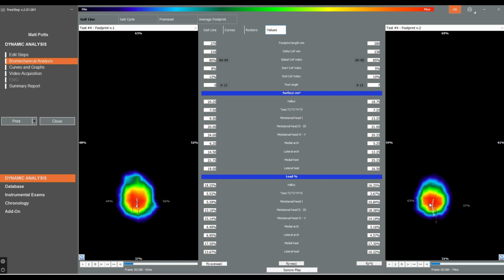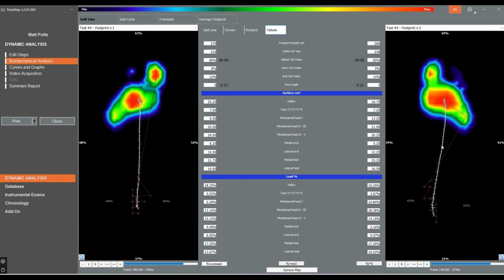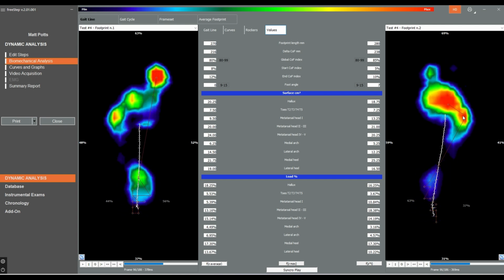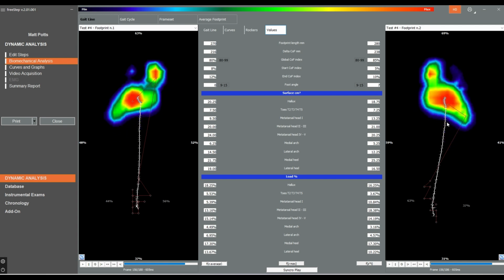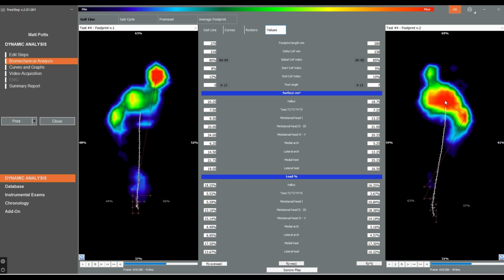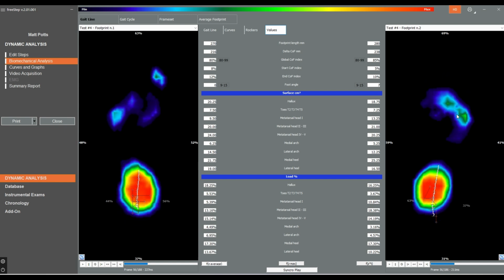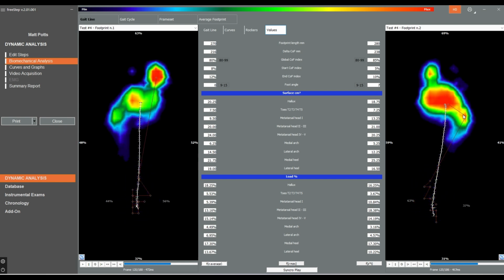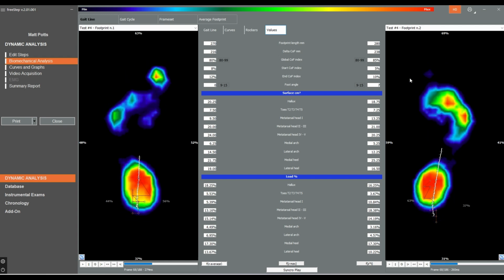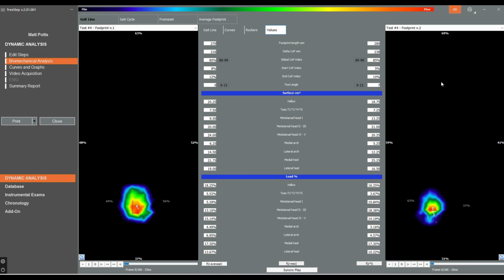Looking at the right foot, again central, we'd like that to be a little bit more lateral. Smooth the gait line, and then a smoother push off through the toe. We do see pressure building up across the metatarsals, but it's smoother. It starts slightly laterally here and then spreads across. That's probably my body overcompensating with a slight amount of inversion to allow me to develop an arch that I know that I'm going to collapse otherwise. So I think that's probably a learned process, either conscious or subconscious.